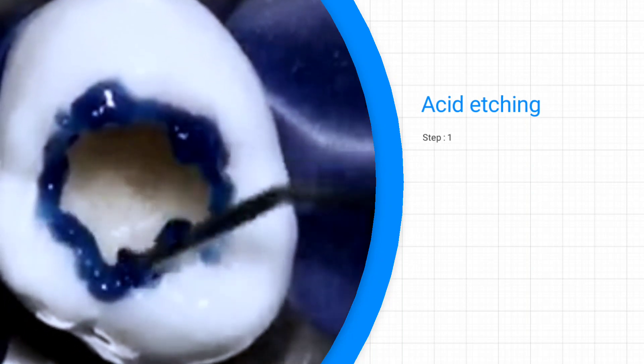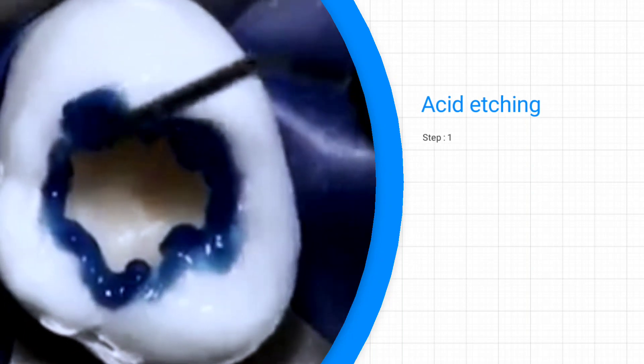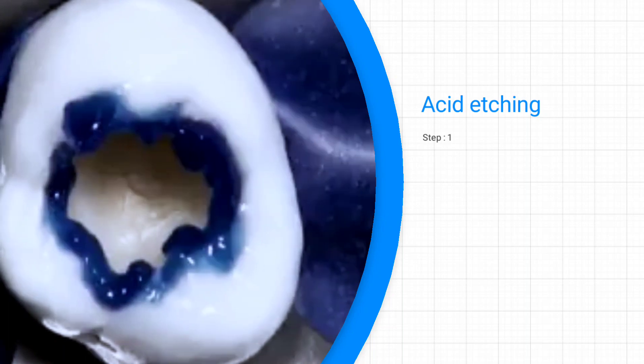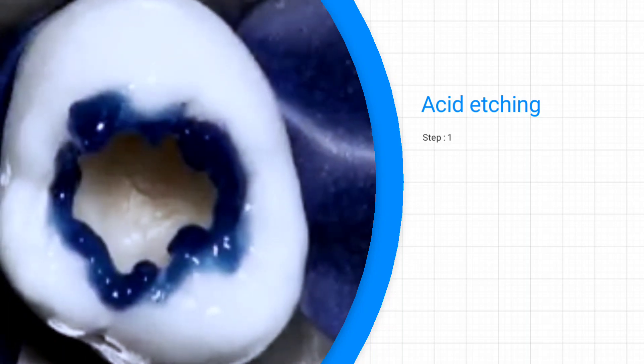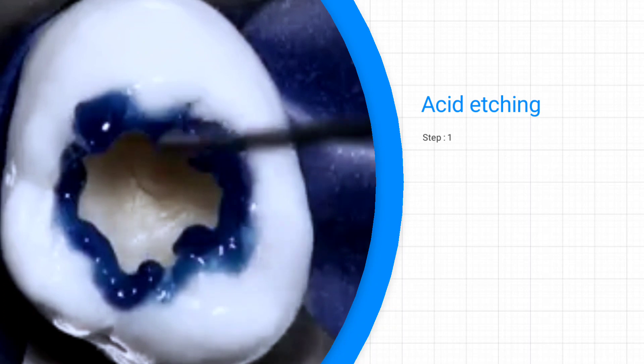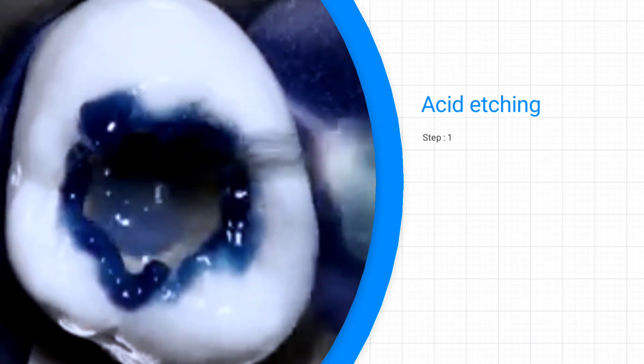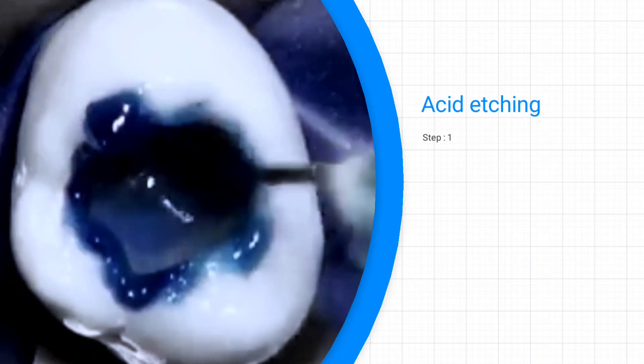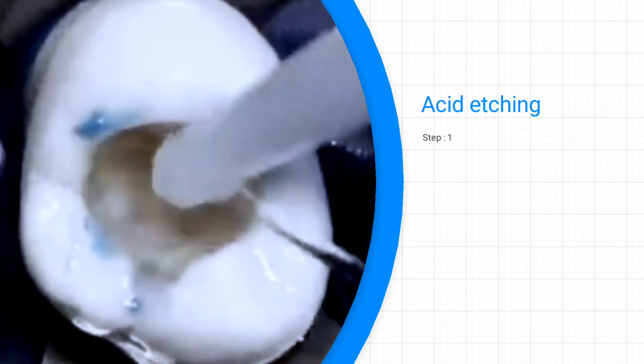Taking out the acid tooth conditioner from the kit. Tooth conditioners contain 30 to 40 percent phosphoric acid, and the conditioner needs to sit on the target area for at least 15 seconds. After that, you rinse it off, and this will make the tooth look like etched glass.